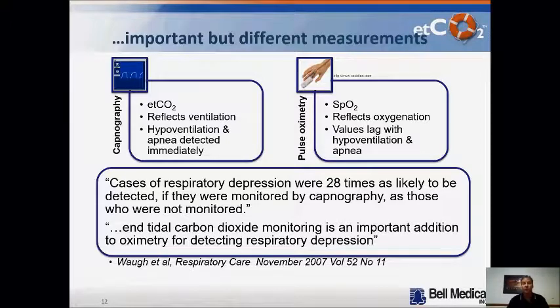So basically, we used to do tests where you would take a deep breath and hold your breath with an oximeter on, and you could literally go several minutes before the oximeter would start dropping from 98 to 96 to 95, and a lot of people cannot even hold their breath long enough to bring it down. Especially if you were on nasal oxygen or an oxygen mask and you were hyper-oxygenated, it could take 3 to 5 minutes before a pulse oximeter monitor would decline to a point below 95% or to a point that you get an alarm generated.